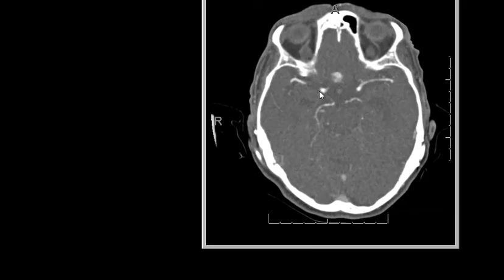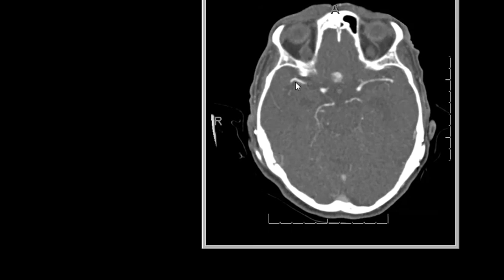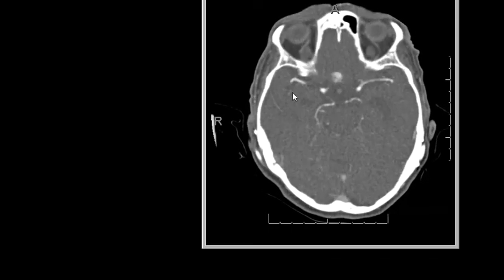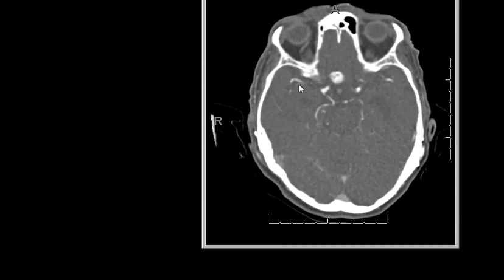And just to remind you that the criteria is for large vessel occlusion, meaning M1 segment and ICA, not this proximal M2. Maybe in the future the criteria will be pushed out to include this kind of patient.